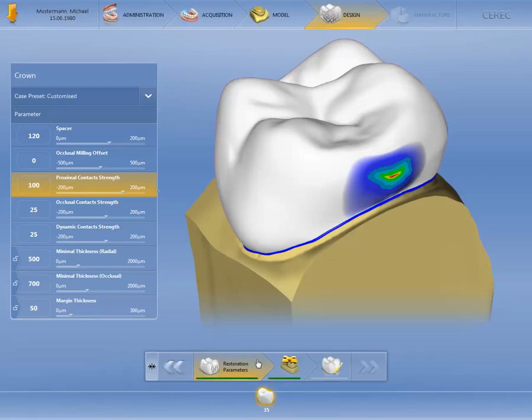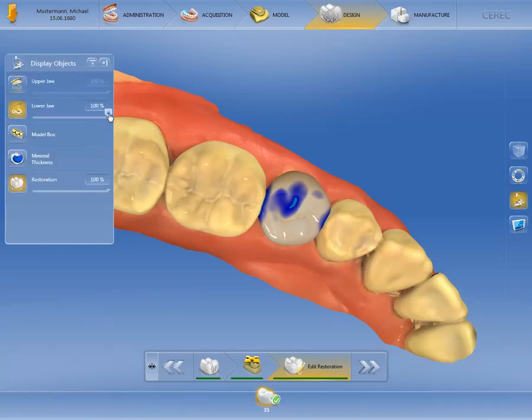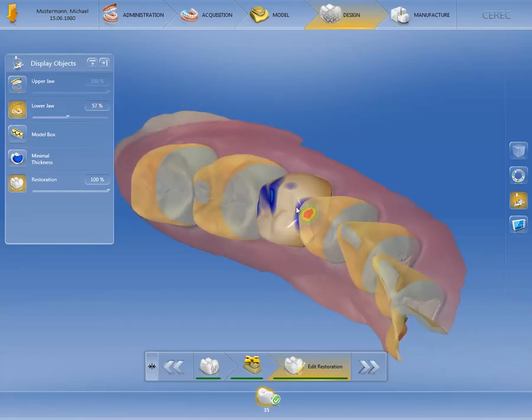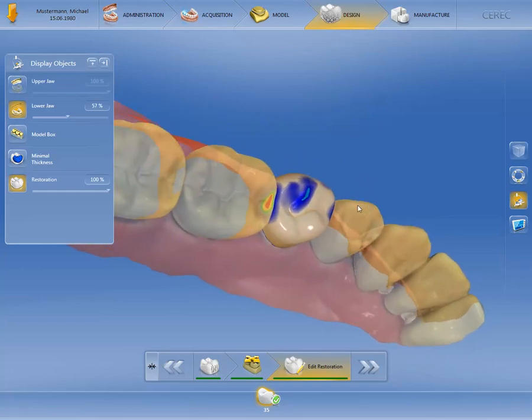Let's now check the result by returning to Edit Restoration. To see the proximal contact strength better, we significantly reduce the visibility of the remaining teeth in the lower jaw. The deep penetration of the proximal contacts is clearly visible.